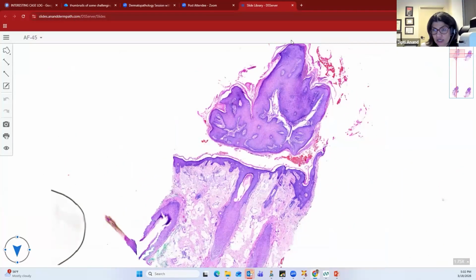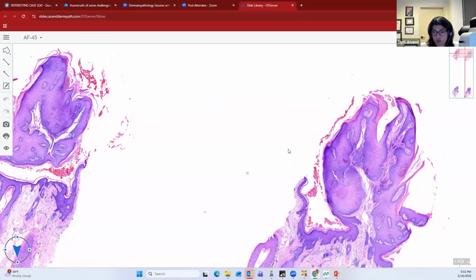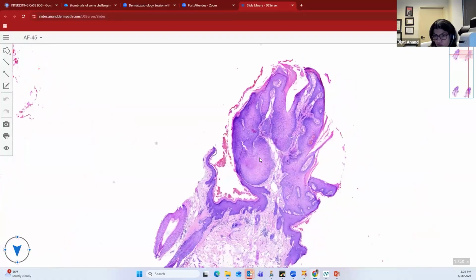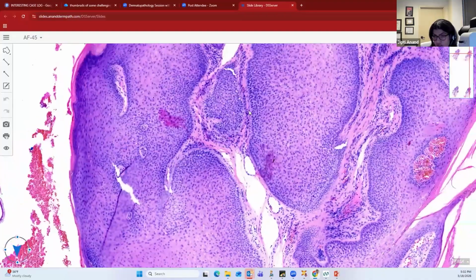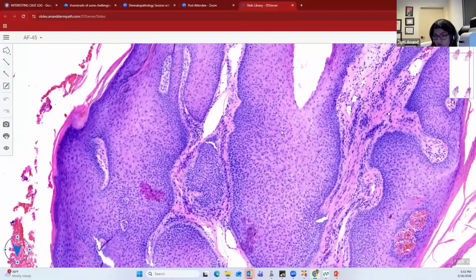Now, this is going to be in contrast to your trichilemmal verruca, which is also a benign follicular tumor, except that clinically it looks more like a wart. So you can see this nice verrucous epithelial proliferation with these fingers, which is classic for a wart. But then you can see that in the next level, arising from the basal epithelium of what appears to be a wart, are these nodules of cells. You can see that over here.